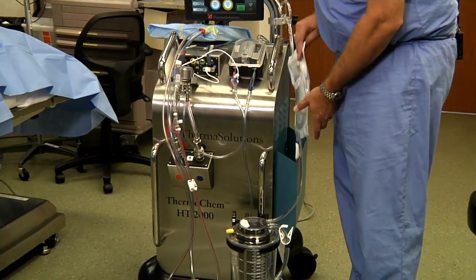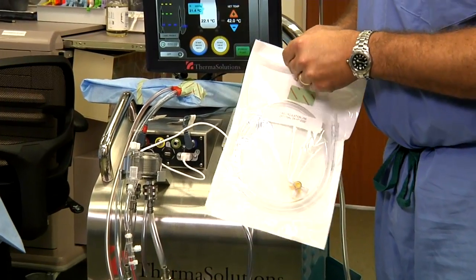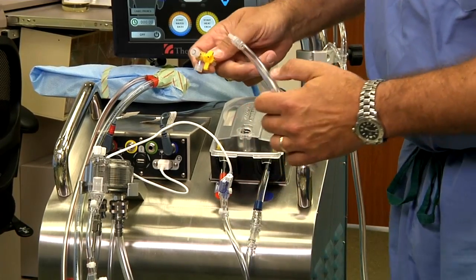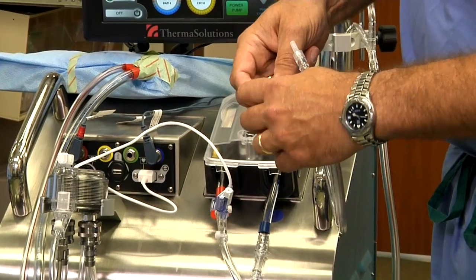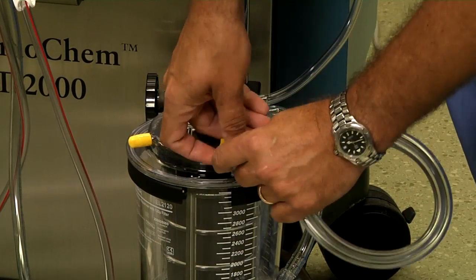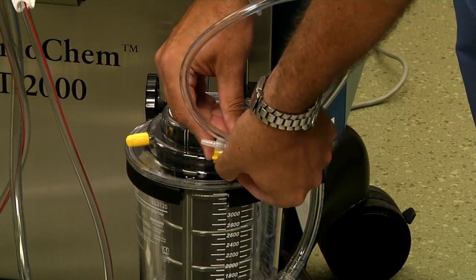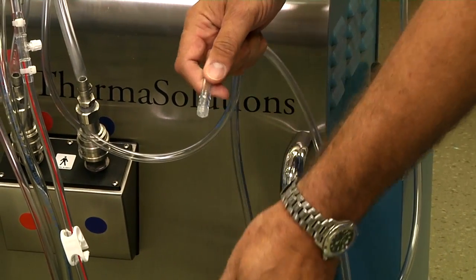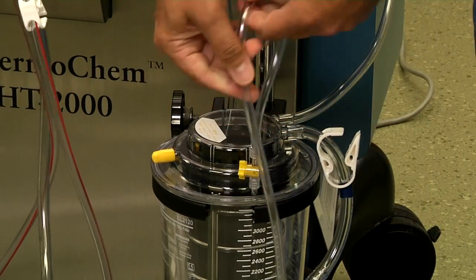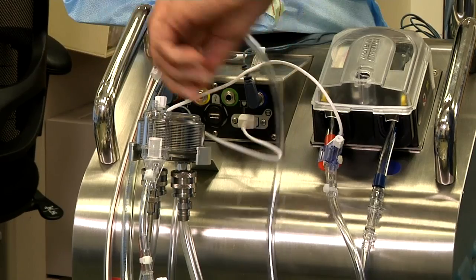The final component placed on the HT2000 optionally is the recirculation line. It contains a three-way stopcock and the line tubing. The stopcock will be placed on the reservoir, and the recirculation line will be connected to the three-way stopcock. The other end of the recirculation line gets placed on top of the heat exchanger.